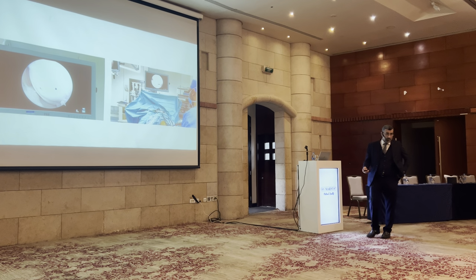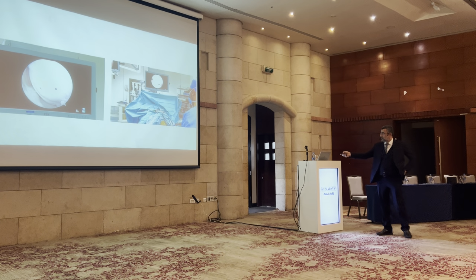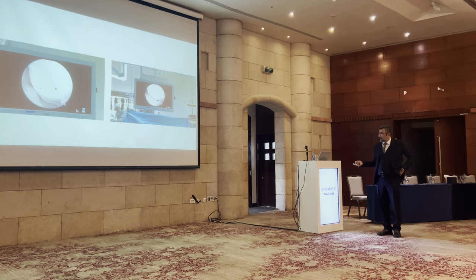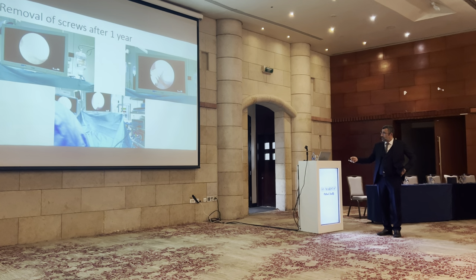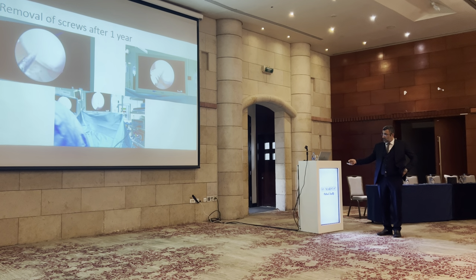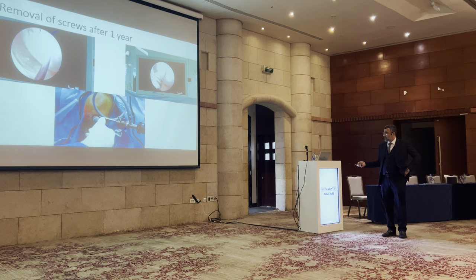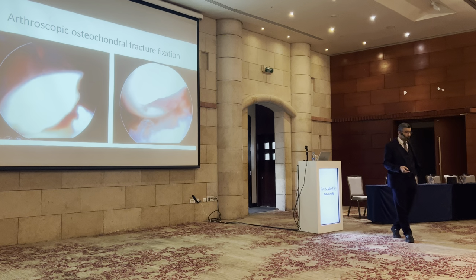Now what we do in these cases, and even in osteochondral autograft transfer, we check for any impingement. Here, we take the knee through the arc of motion and see if any impingement occurs. It was fine here. So here, post op. Here after a few months, well healed, and this is on screw removal. Look how it is very well healed and integrated. I always advise the patient to remove these screws. And look here, the screwdriver, and here the screws are. So when the subchondral bone is not diseased, you can fix it.